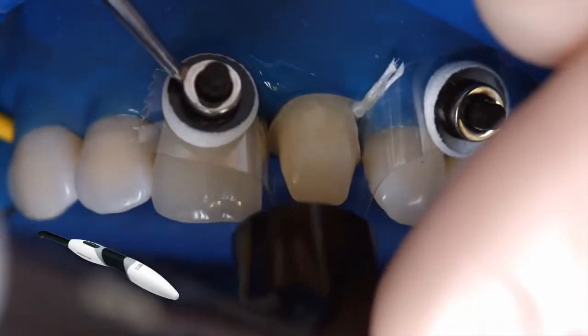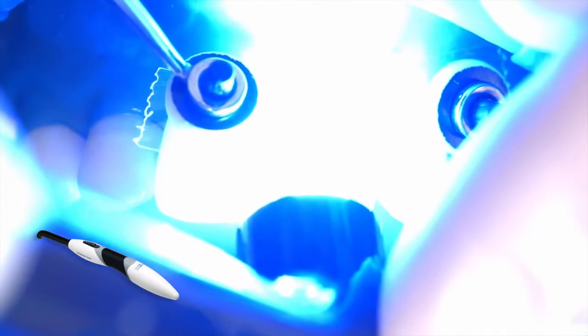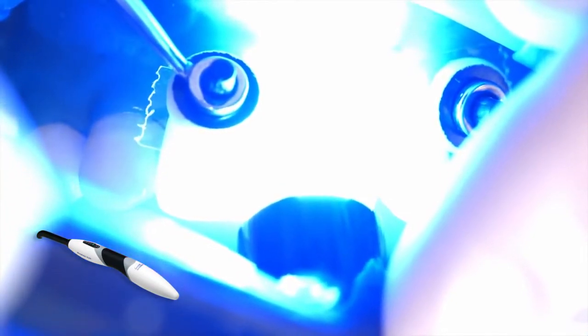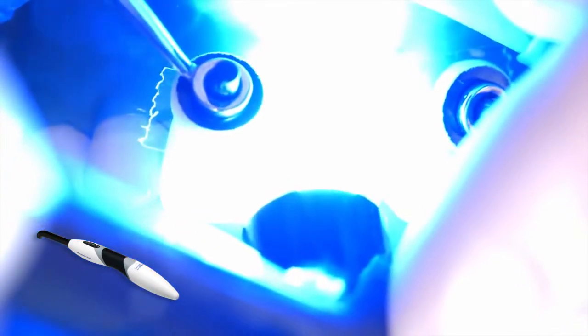Light cure Adhese Universal for 10 seconds using a curing light with a light intensity of at least 500 milliwatts per square centimeter, for example Bluephase Style.